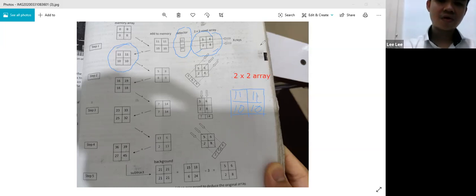And if you go from the right side, from the X-ray from the right side, the next step, the X-ray will rotate, right? So now the X-ray you see is coming from another angle already. So you get 3 slices if you take from there. The first slice is still 5. The second slice, you pass through 6 and 2. So you have to add 6 and 2 up, which gives you 8. The last slice is only 8.